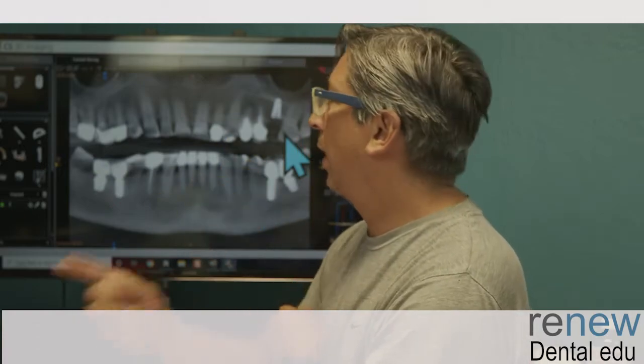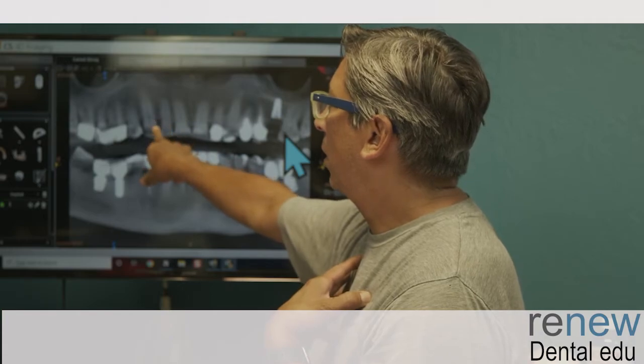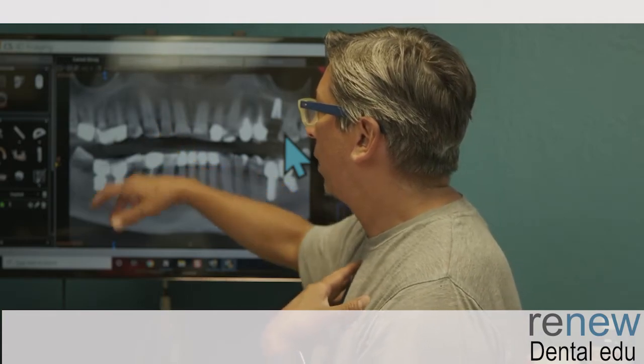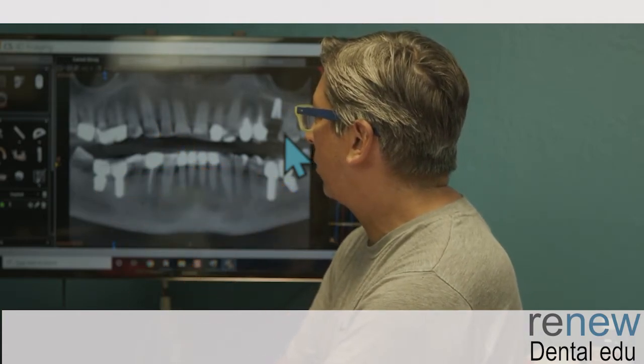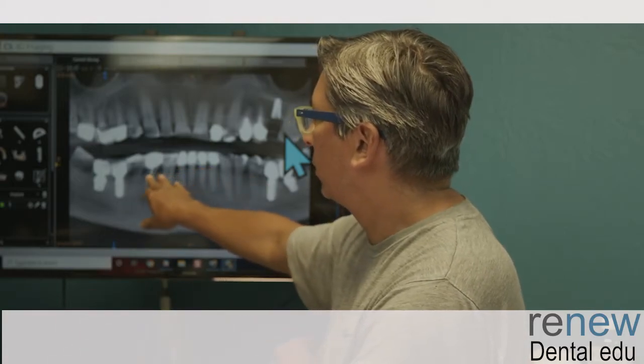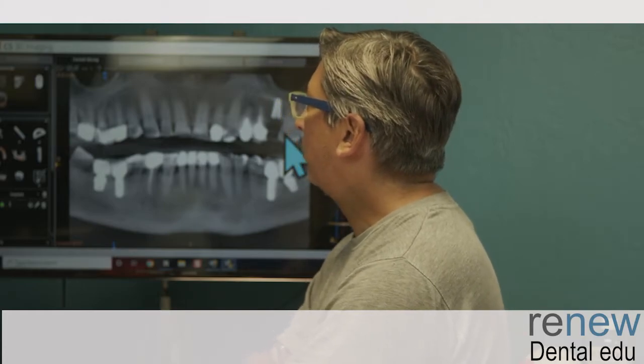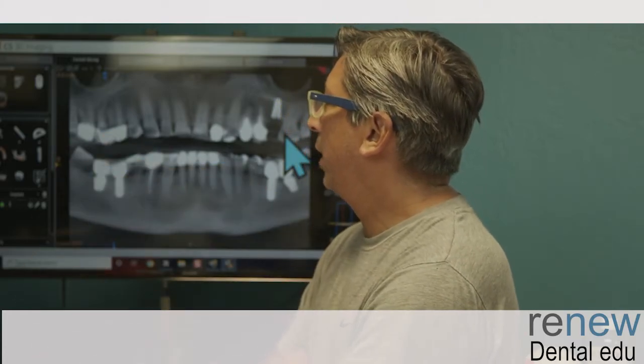He's got some tori building up, but you can see the wear and tear on his teeth as well as poor oral hygiene. He's got some bone loss around. You can see some calculus right here on this lateral, and he's starting to exhibit possibly some horizontal bone loss from the oral hygiene issues that he's starting with. So let's evaluate number 3 first, and then we're going to look at the other ones.